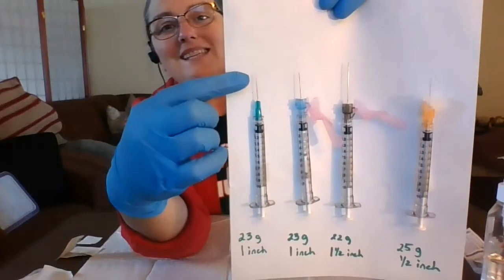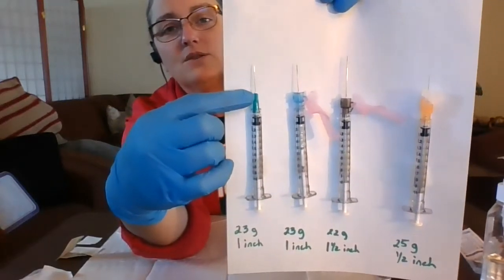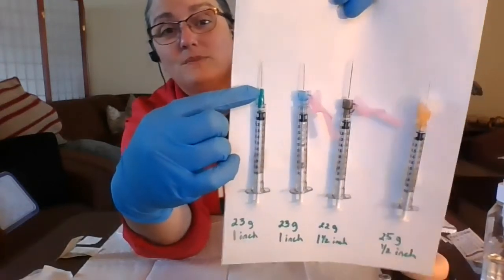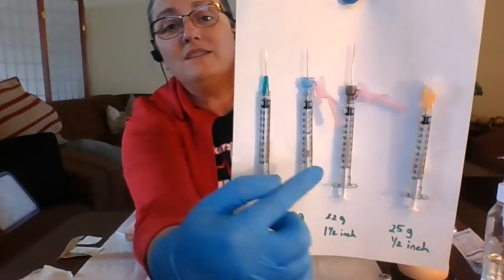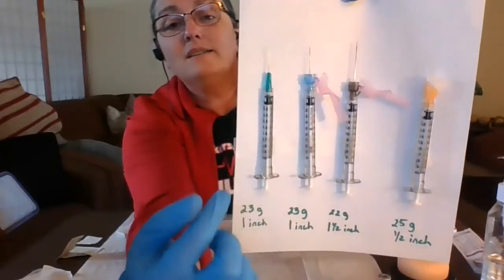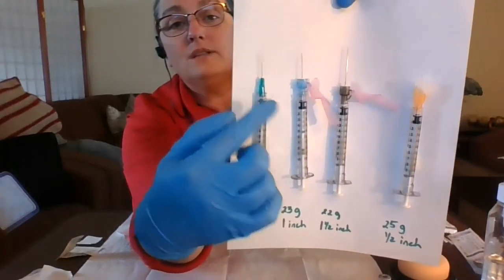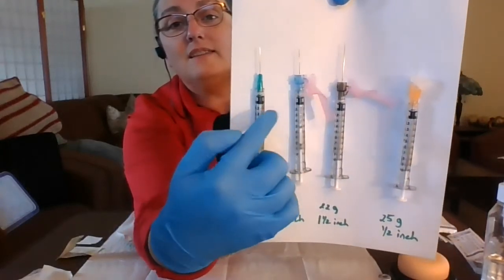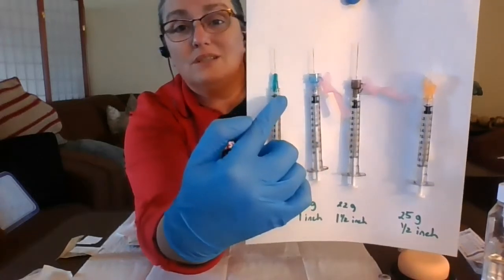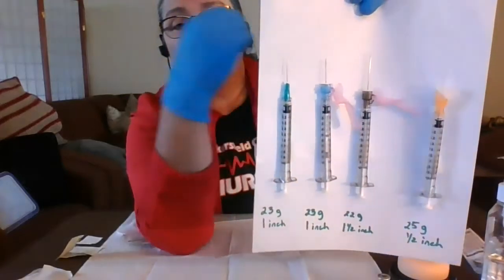The other thing we need to think about is the length of the needle, because when we're giving an injection into the muscle, we want to just be in the muscle. We don't want to go past the muscle. You can see here, both of these are 1 inch, and that's the appropriate size. They're actually the same size. They're 23 gauge, 1 inch needles. The only difference is this one has a safety and this one does not. These are appropriate size for adult deltoids. This is what we would use for an adult deltoid, which is the muscle in the arm.